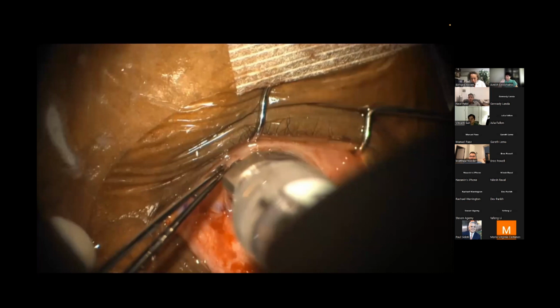So I've sometimes had these conversations with fellows where they'll be like, well, I know they're phakic, but let's go ahead and try to mosey a vitrector in there and just start to cut up some things. And I'm like, don't do that. Figure out why the air came in the first place, and don't just assume unicamerality, so to speak. And this is an example of that. I hope, maybe the oil is going to be forward when you show us the next image, but in general, it doesn't necessarily mean that.